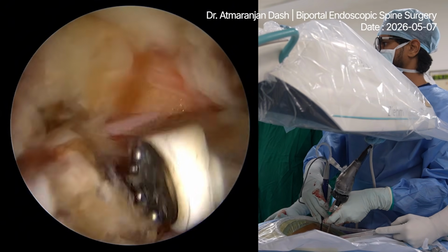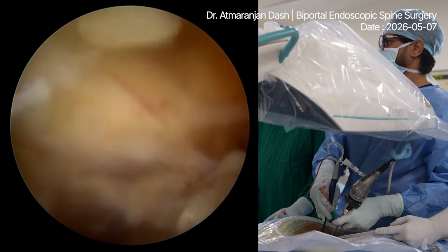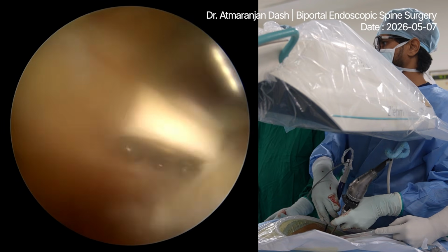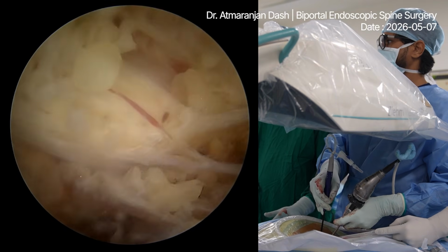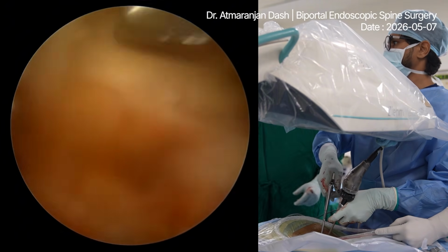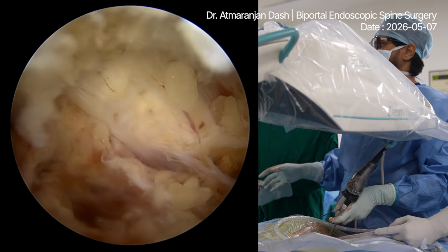Carrison, please. Use a curved carrison always in these areas, because it's foraminal work.